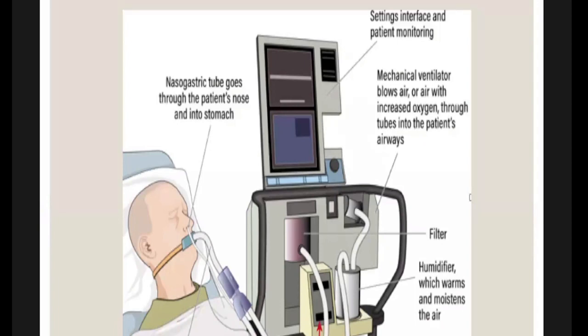And here we have the compressors. In the compressors we get a blend of medical air, which is actually the atmospheric air but filtered, which is known as medical air, and then it is being blended with oxygen. So depending on the percentage of oxygen we fix here, the patient gets the set FiO2 through these tubings.